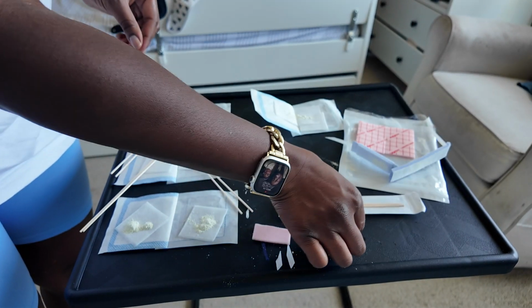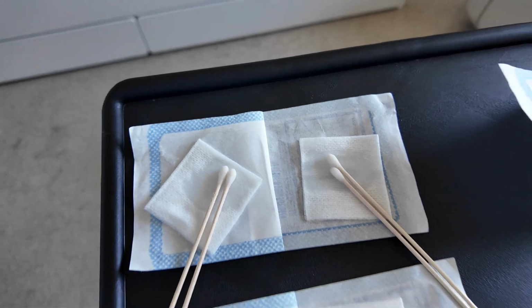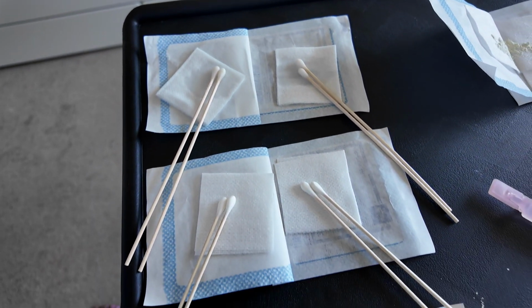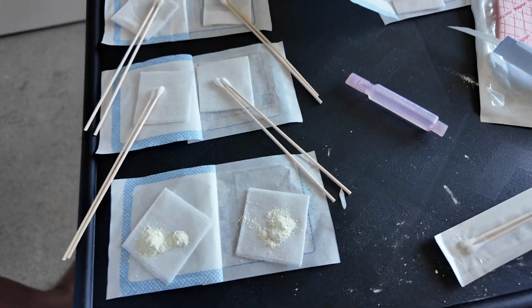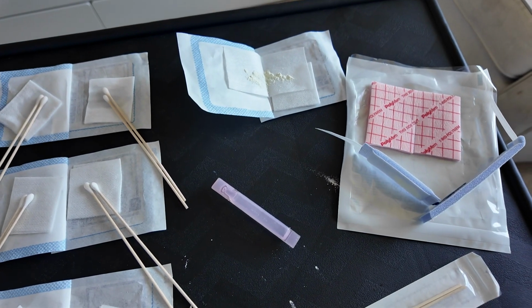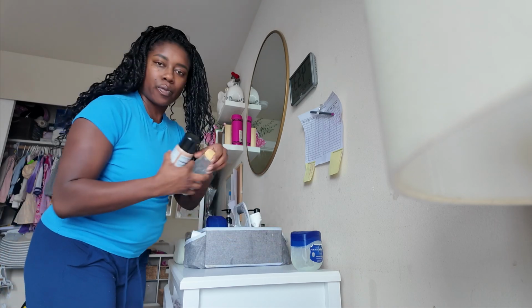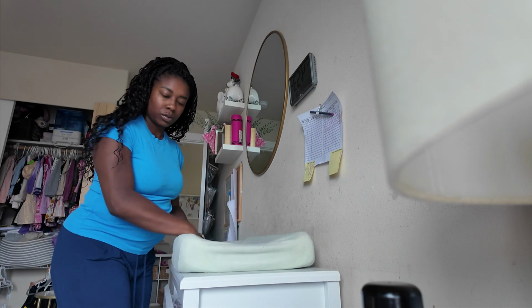Again, some people use gloves for this portion. I use gloves when we get into actually doing trach care. So as you see, we have wet, we have a dry, we have powder, and then we also have this gauze we added on later for the back of her neck. I'm cleaning out our station. We've done this on the floor on the changing pad. We just started doing it on the dresser, and it feels like it works a lot better for us.